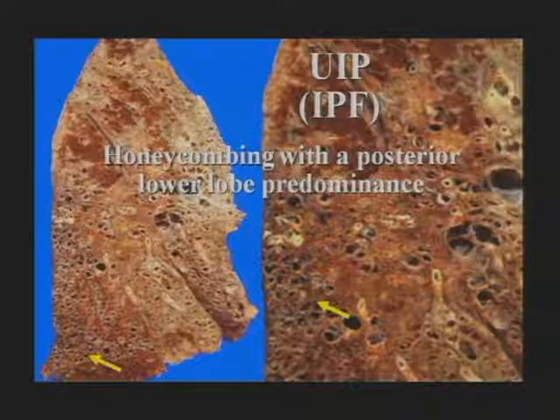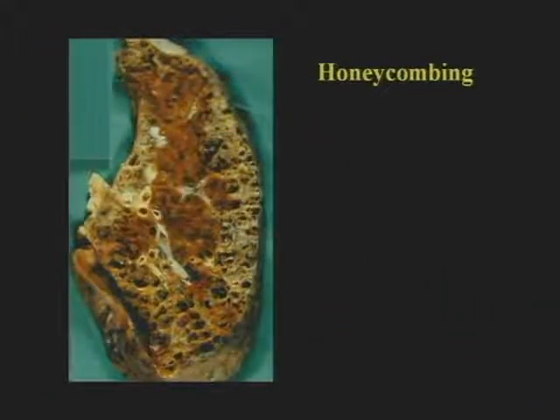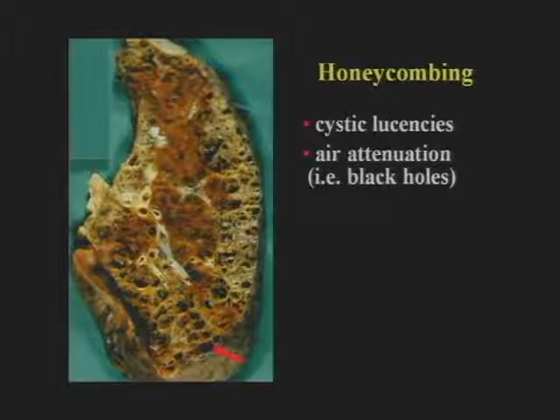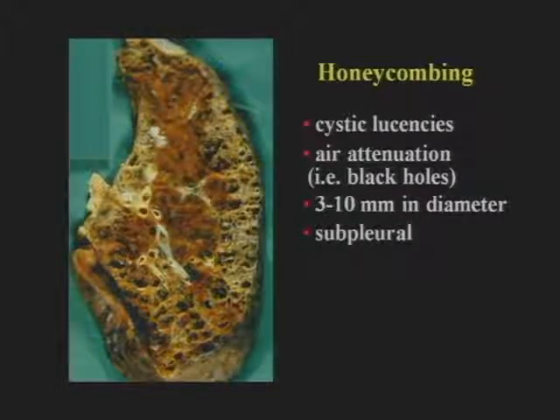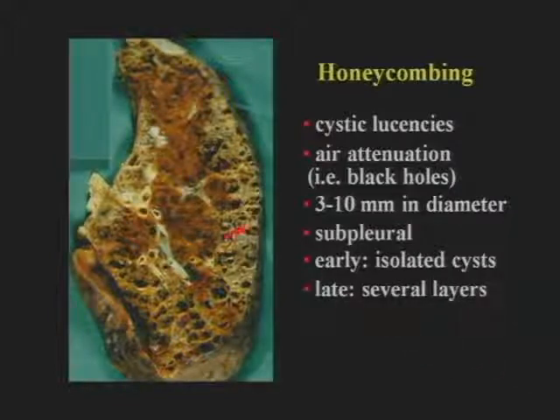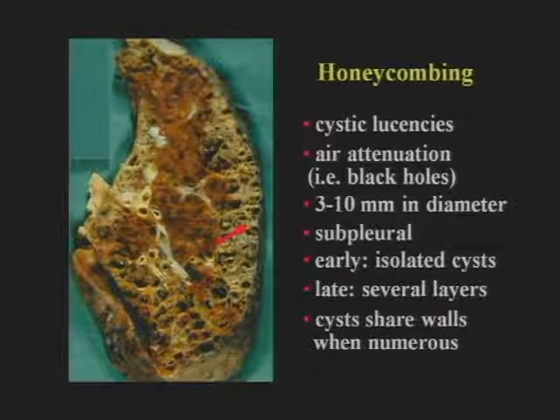This sagittal lung slice in a patient with UIP-IPF demonstrates honeycombing with posterior lower lobe predominance. Honeycombing indicates cystic lucencies that are air-containing — empty holes that should look absolutely black on high-res CT. They are three to ten millimeters in diameter most of the time, but may be larger or smaller. They must be seen in a subpleural location, or you cannot be sure they are honeycombing. Early on you only see a few isolated cysts; later, cysts occur in several layers and share walls when numerous. They tend to occur in clusters and have a recognizable fibrotic wall surrounding them.